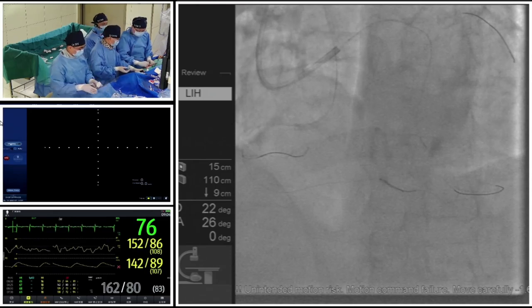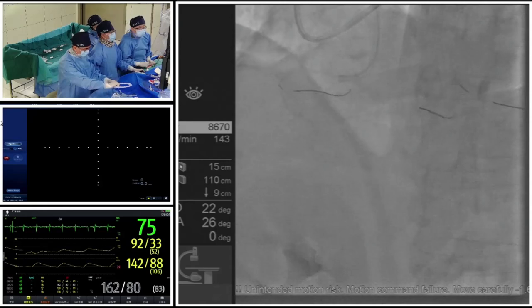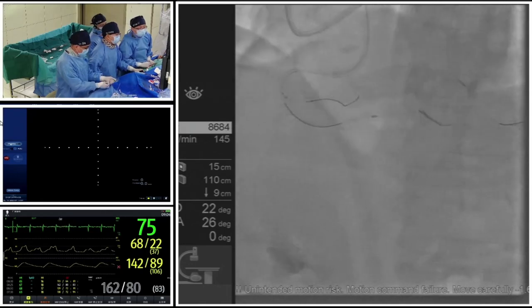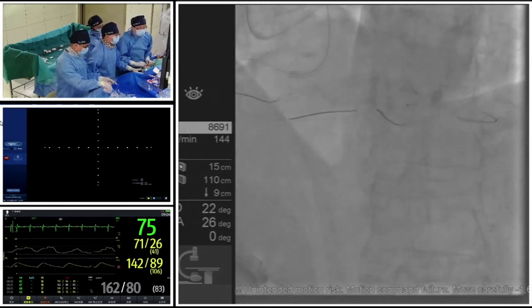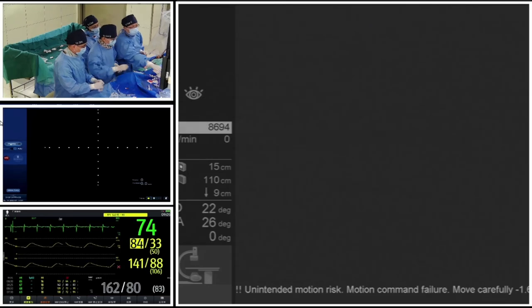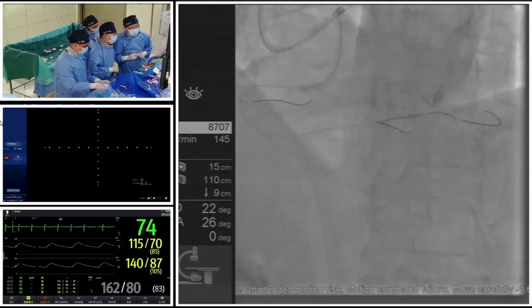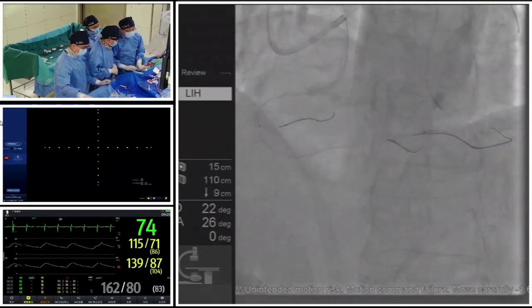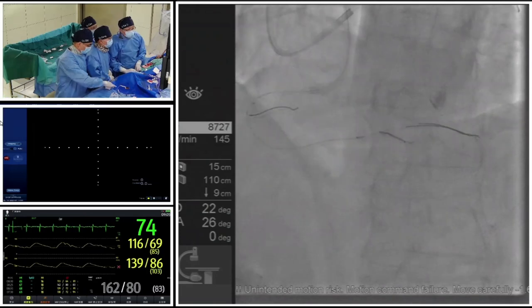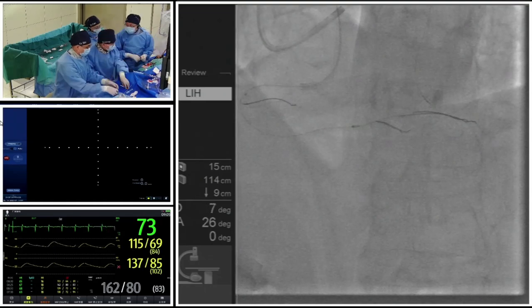Professor Lee has just developed a unique technique to stop septal perforation and other small perforations of the septal branches. It's called successful occluding by absorbable sutures for epicardial collateral branch perforation. One tip and trick: when we use a dual lumen catheter, we should advance the catheter a little bit further and make the wire come to the distal true lumen. Then we withdraw the dual lumen catheter. Please go on to introduce the technique.